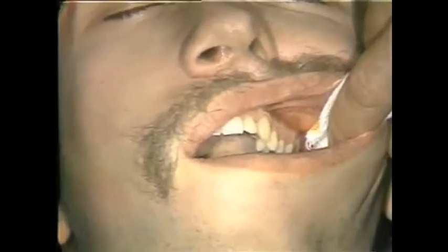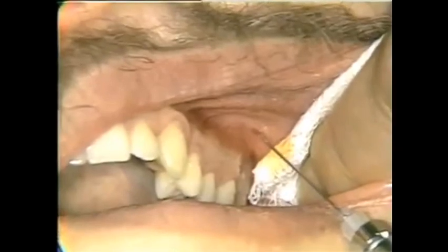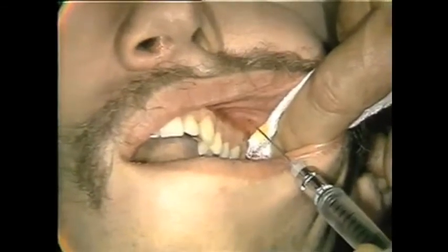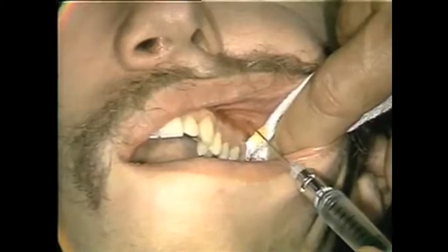Now you'll notice that again with the cheek retracted, how tense the vestibular tissues are. Out in the vestibule, and I'm approaching the mucosa at about a 45-degree angle, as you can see. Puncture made, carried quickly to bone, and then we aspirate. And then we'll inject a good 2 cc's of solution to anesthetize the maxillary first molar.